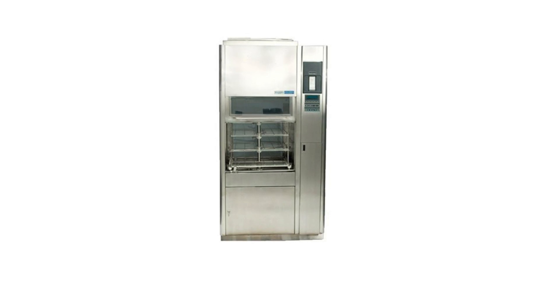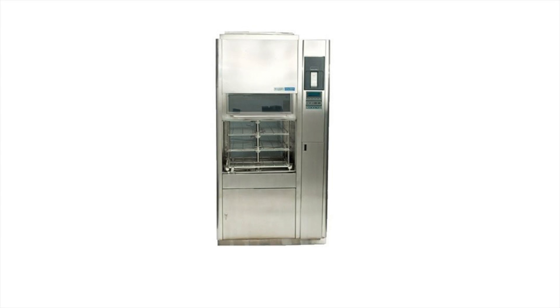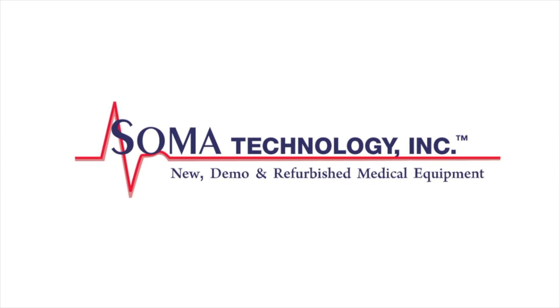To view more information about the Steris Reliance 444 washer and disinfector, or other products, please visit somatechnology.com.